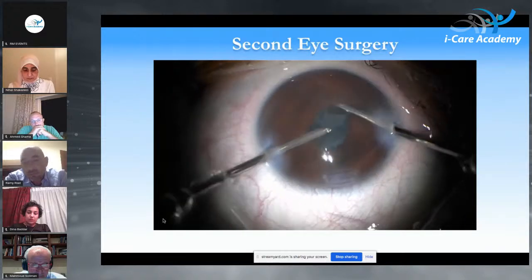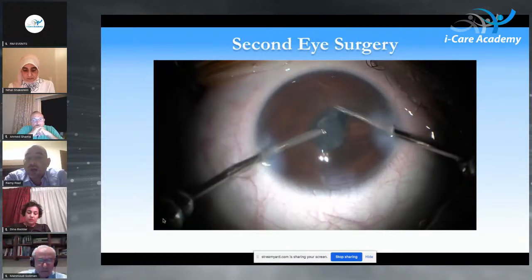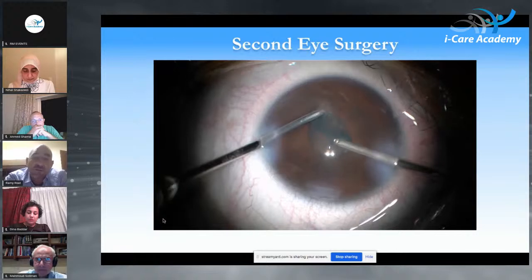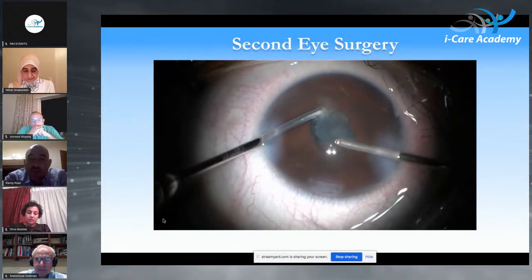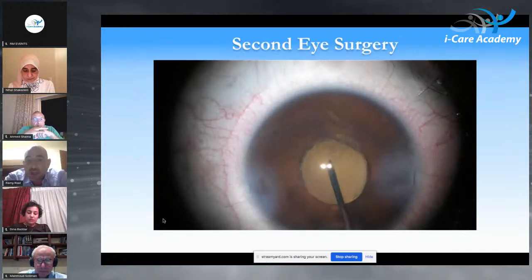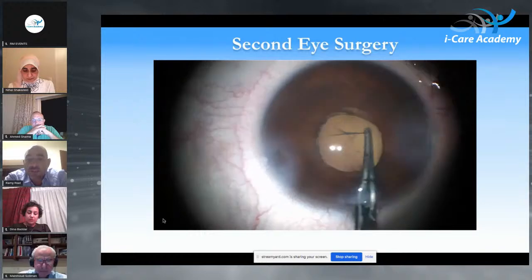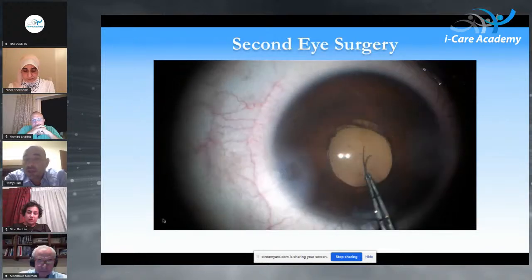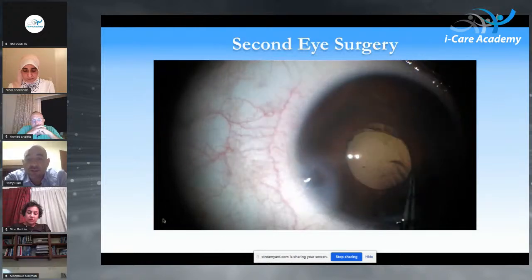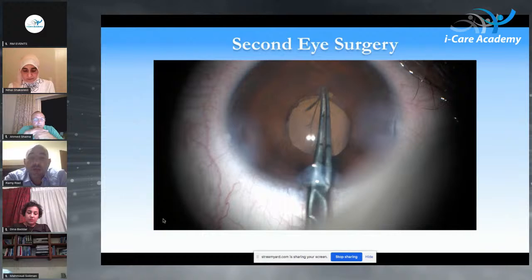And then, because it is smaller, with the use of the spatula, you could push the iris away and start fishing for the lens quadrants and particles from behind the iris. Again, at the completion of the IA, posterior rexis with the size of 4 millimeters, as advised by our colleagues and professors. And again, this concludes our surgery.